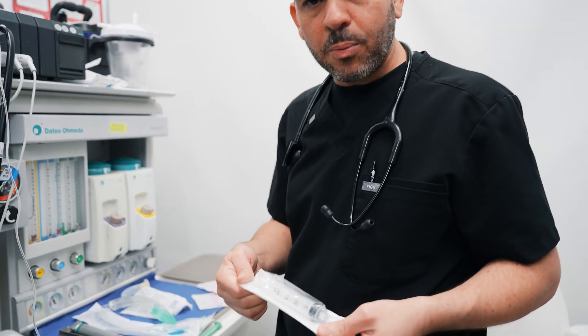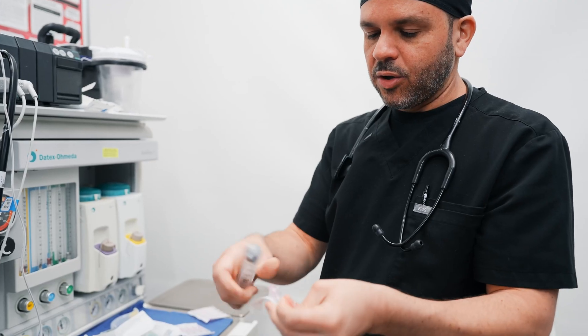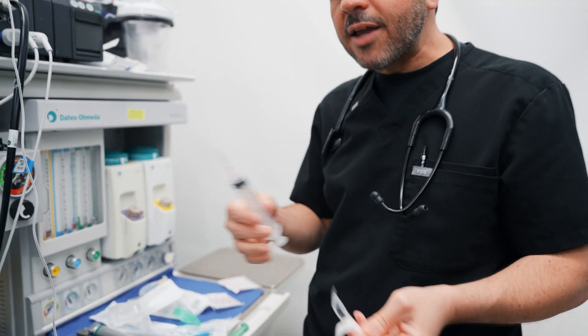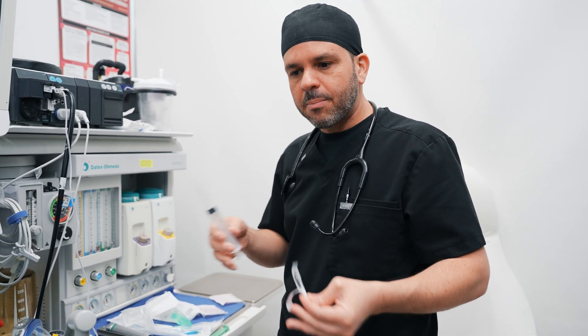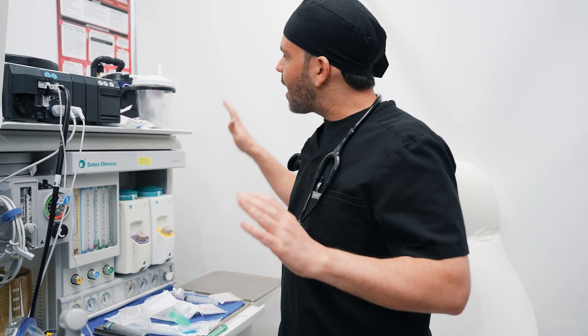These are my syringes for the medications I'll be drawing. Usually I always have a 20 ml syringe with a needle to draw up medications to deliver to the patient during induction and during the procedure itself. I always use one brand new syringe for every single medication, every time that I'm drawing.